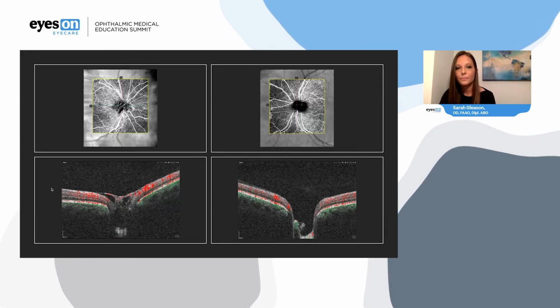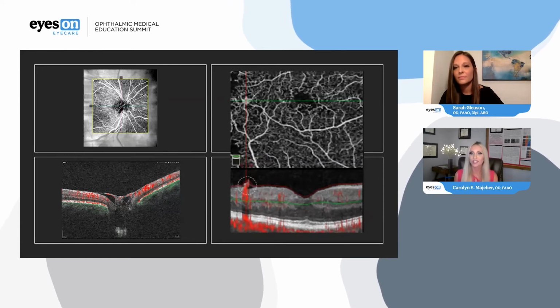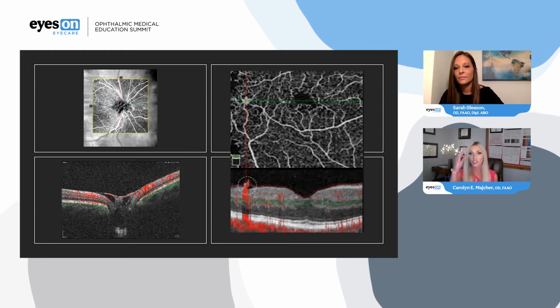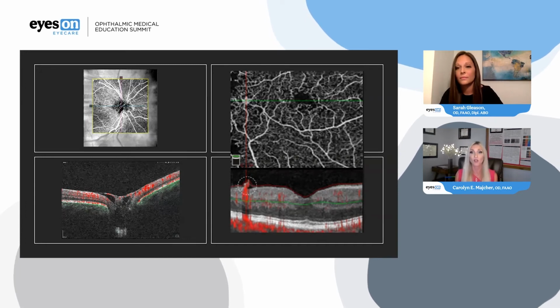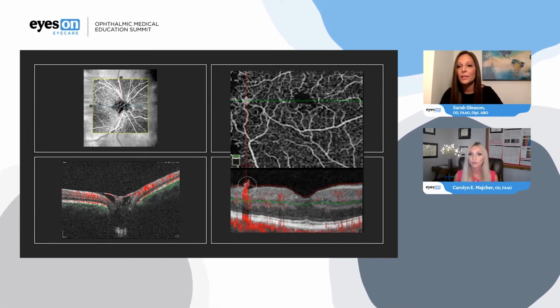I think even without OCT angiography, let's say you're in a practice that doesn't have it, if you're doing just structural raster scans through the optic nerve, you have that classic presentation of neovascularization of the disc, which I like to call a hammock hanging across the cup, or that pre-retinal tissue. Sometimes in patients with bad cataracts, poor fixation, or nystagmus, I'll use a raster scan to look around the posterior pole or scan across the nerve, looking for areas of tissue sticking up out of the retina that may signify pre-retinal neovascularization, or as in your case here, neovascularization of the disc. Absolutely, and that's a great point, because not everybody has OCTA capabilities, but if you have OCT capabilities, you can still use those tools to pick up that neovascularization.